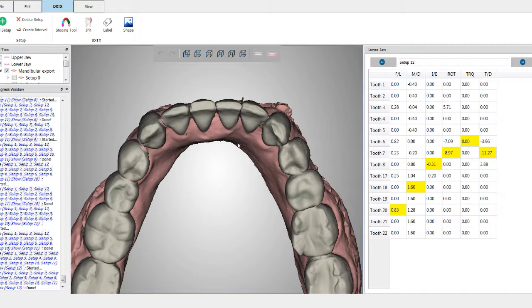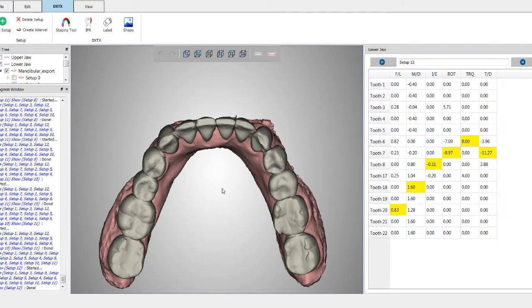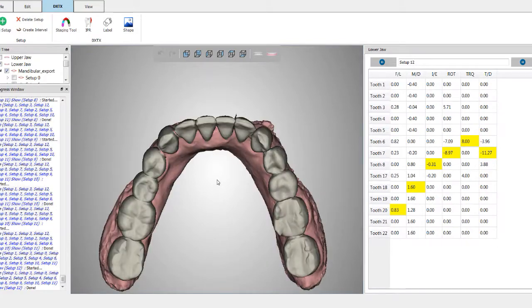If there's any contacts the floss binds, my assistants have a little IPR strip out, and so I would just do a little bit of IPR in between the teeth, anywhere that there's some binding, and that really just ensures that you're reducing the collisions and also doing IPR when and where it's needed, kind of on an on-demand basis. And I found that to really help. It's a very quick and easy thing to do, and just allows the tooth movement to be much more efficient.